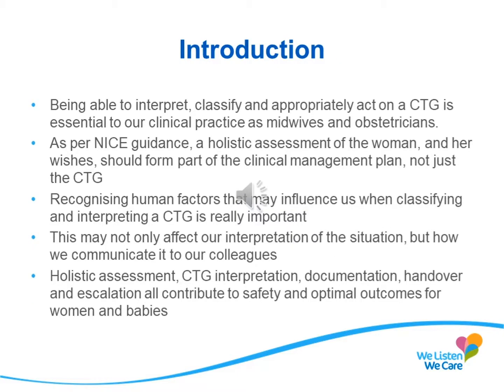Being able to correctly interpret, classify and appropriately act on the CTG is essential to our practice as midwives and obstetricians. The interpretation of the CTG has to be done in the context of a holistic assessment of the woman and her wishes. This should not only form part of our clinical management plan, but also our documentation around CTGs.